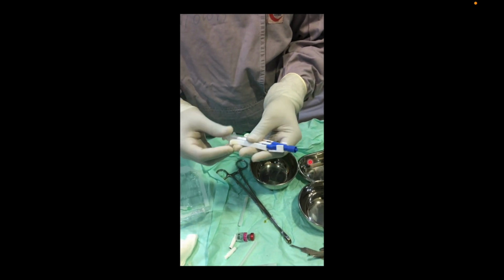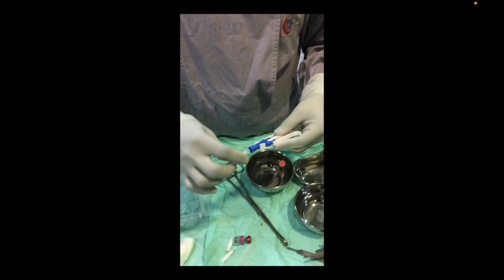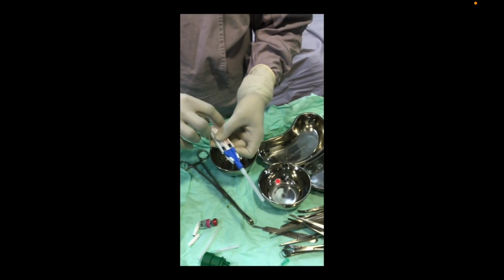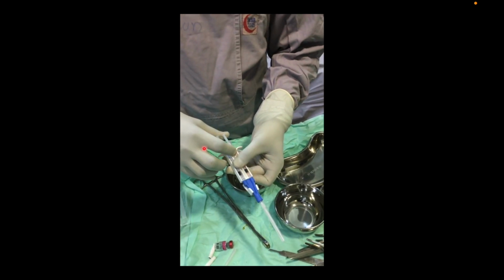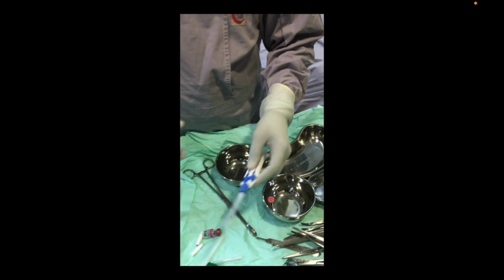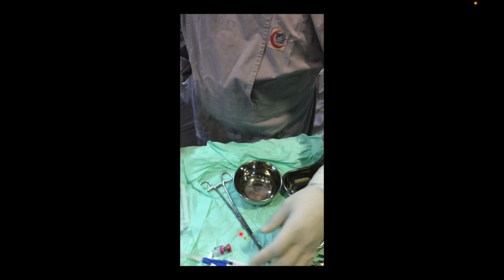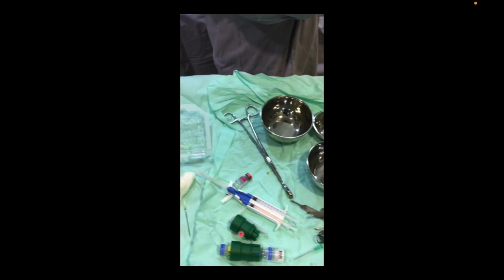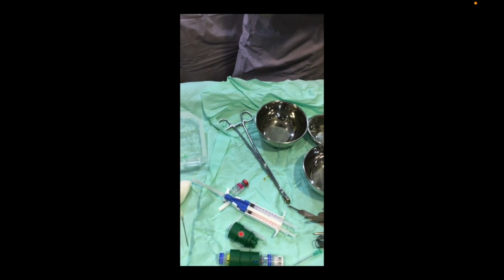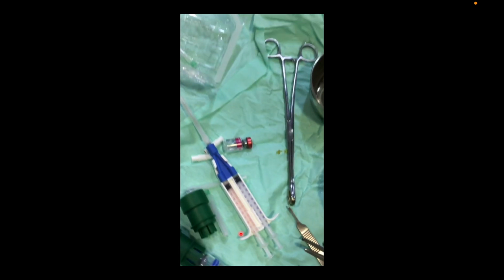So all you do is you attach a long needle at this end, the same needle that we attached there for injecting. Now your plungers are back, the syringe is filled up, so you inject together, and both of them will go together into the pseudoaneurysm. But thrombin works immediately. I'm not sure why they did not inject fibrin.